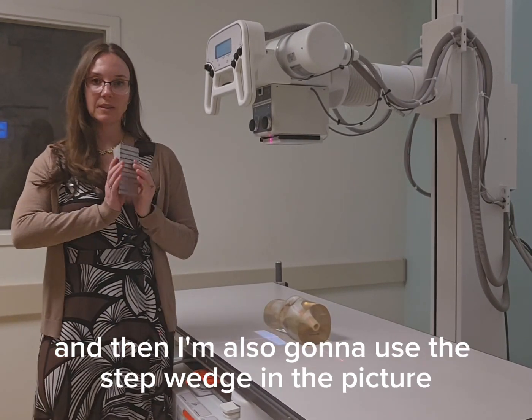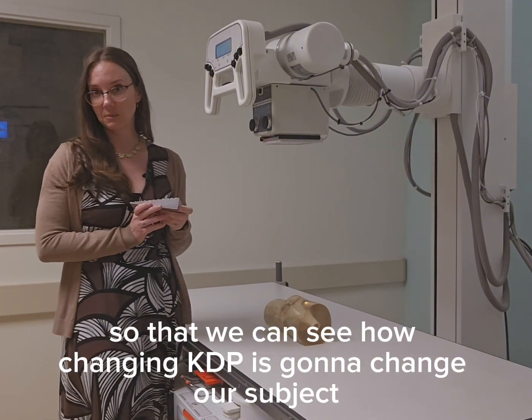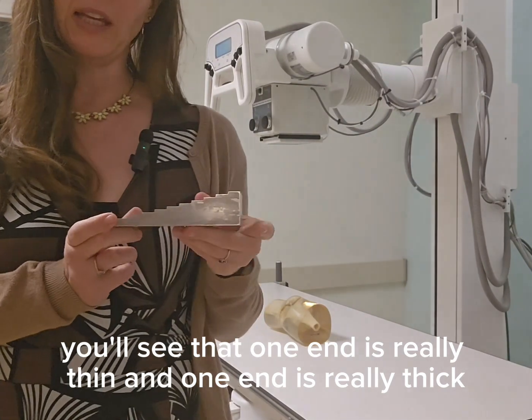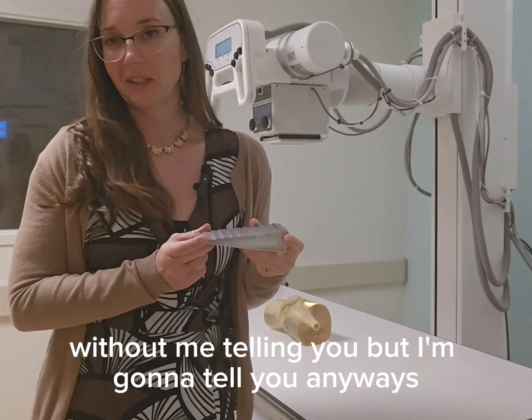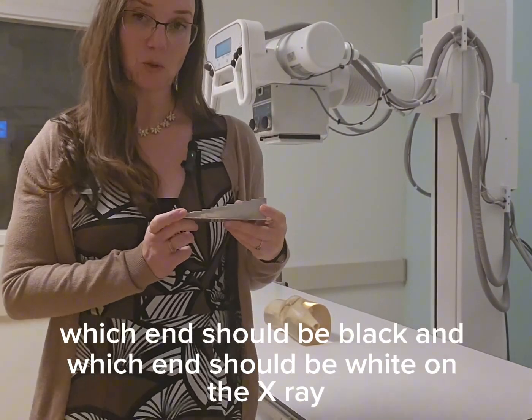And then I'm also going to use this step wedge in the picture so that we can see how changing kVp is going to change our subject contrast. So with the step wedge, you'll see that one end is really thin and one end is really thick. Without me telling you, but I'm going to tell you anyways, which end should be black and which end should be white on the x-ray.